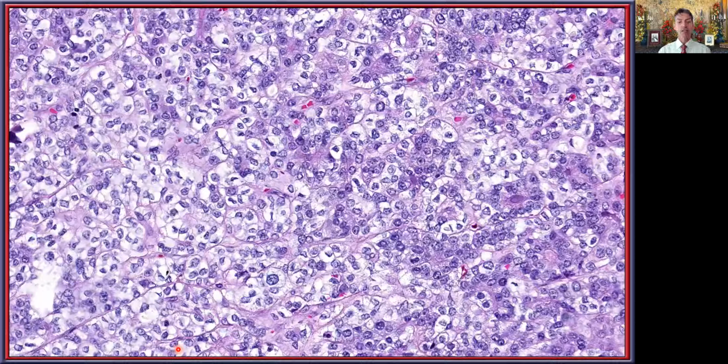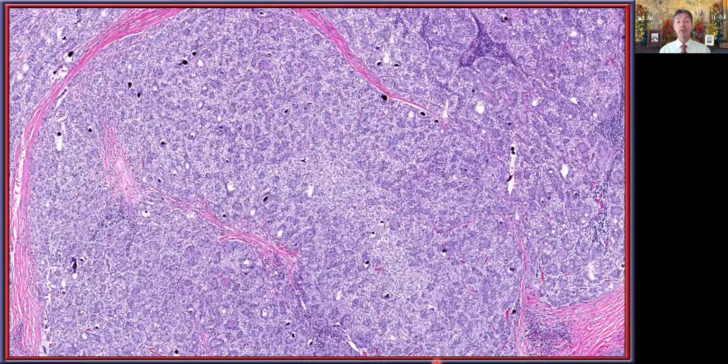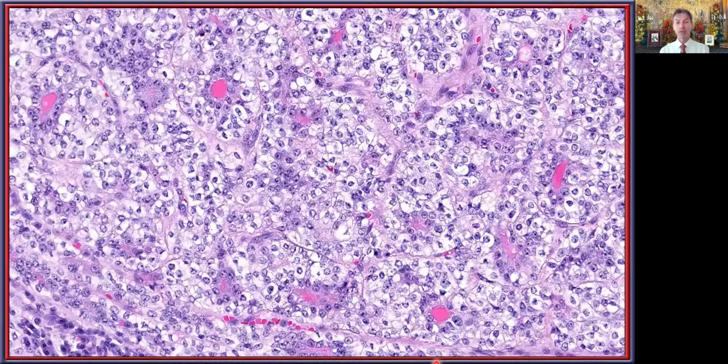However, as you go from this space where it seems to be almost a single cell population, even though it isn't, but it seems that way, and then you go into an area like this and you can see that it just transitions imperceptibly. Now you can tell that that luminal component, although the lumen is compressed, does have a different appearance than the surrounding myoepithelial cell compartment. And so when you think about these tumors, and here on low power, I think now you can really tell very nicely that it does have those central luminal or ductal appearance with the surrounding myoepithelial cells.